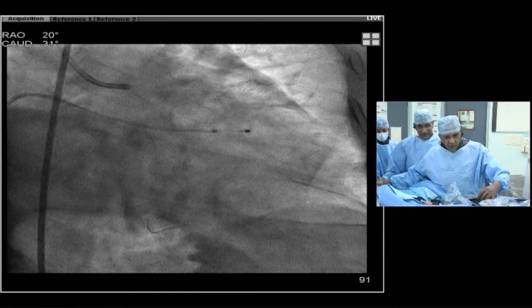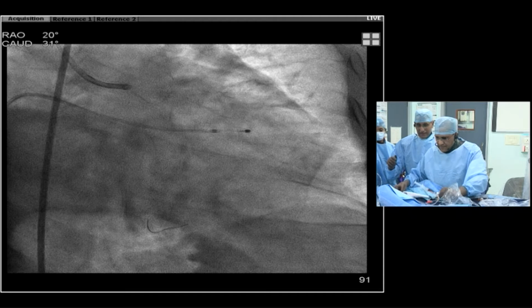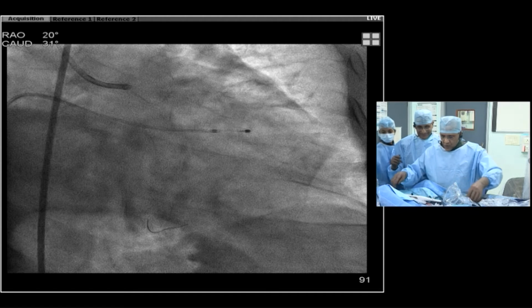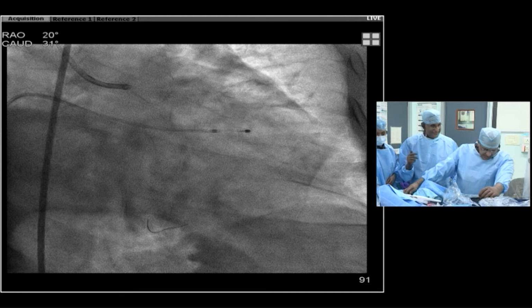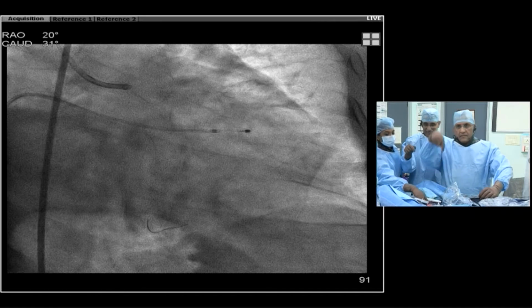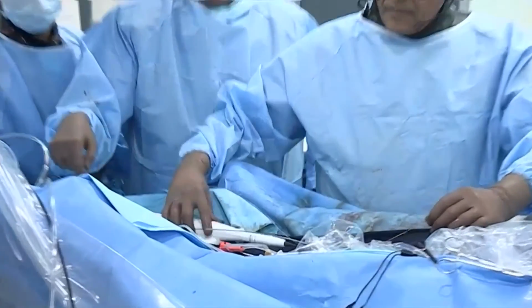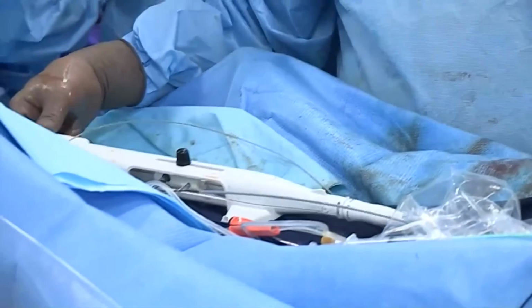Yeah. So here's the story. So this is what I do. So this is Kirti's one-man, two-hand technique. Okay, so what I can do is zoom in on this. Instead of showing the screen, can we see full screen of Kirti right now? Just show me full screen, just focus on him here. All right, so this is he makes you see this?